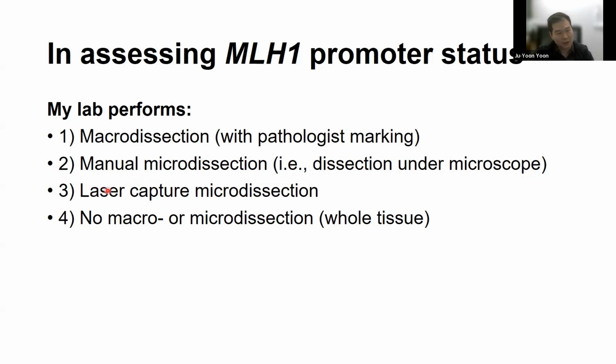I'm kind of glad that no one chose 3, because I see this in the CAP surveys all the time, and I always wondered to myself, who has the time to do this in the clinical lab? I have a feeling that no one really does. I've done this for research, and it's very important for some settings and certainly some research questions, but it takes me hours to cut anything out. So I'm always curious, who has the resources to devote to that. But I think macro dissection is certainly the most common practice.